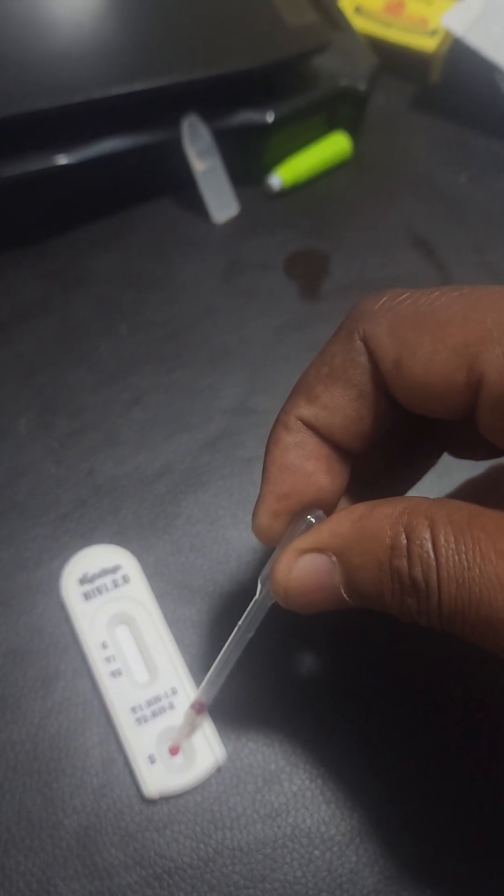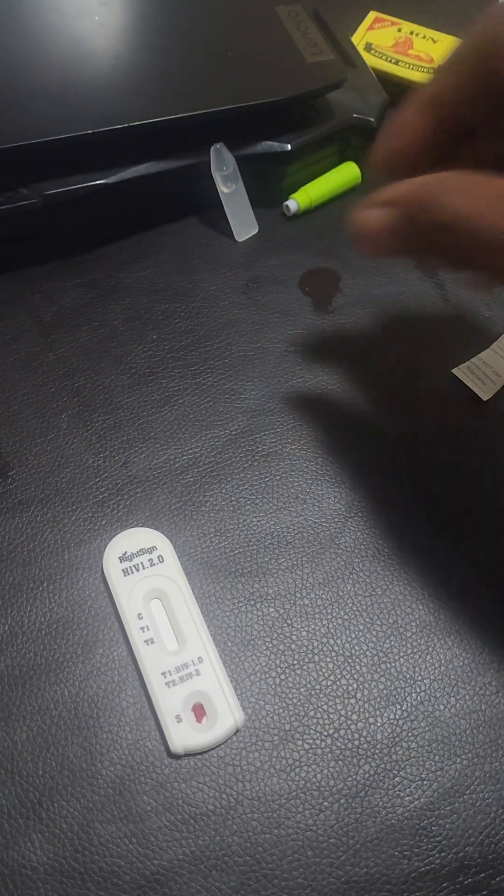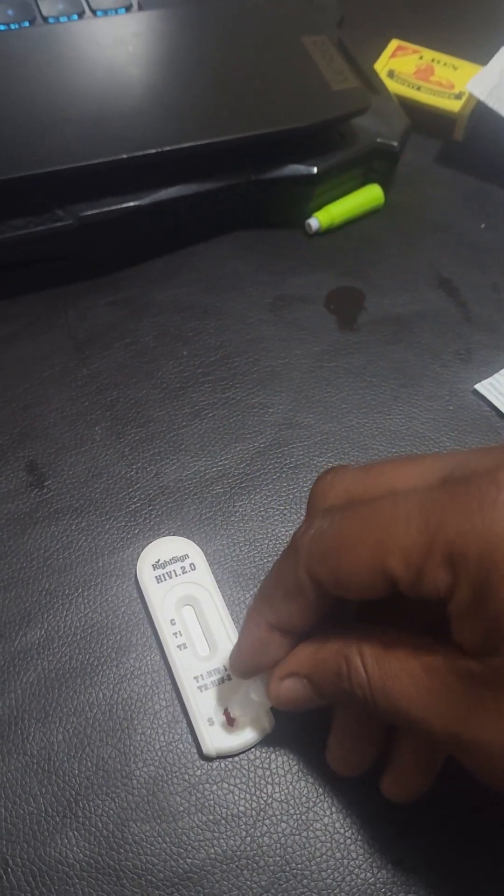After cleaning the area where you will take the test — which will be your finger — you will then prick yourself with the lancet by pressing it firmly against your finger. After collecting the sample, you add it into the area where the sample goes in on the test cassette, followed by the buffer solution.